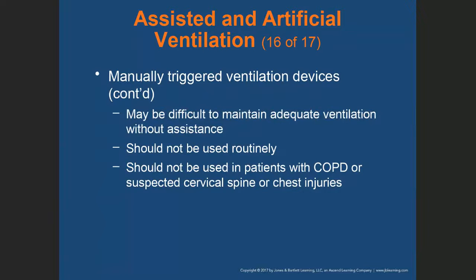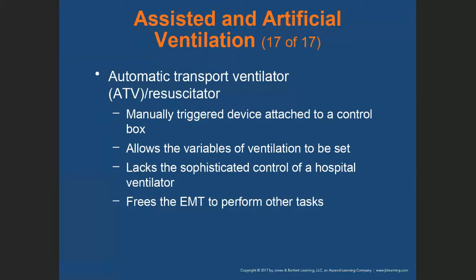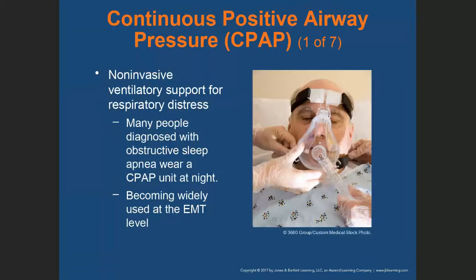Right, so I'm not going to spend a lot of time on that. The ATV is similar to the mechanical one. The difference is you don't have to press any device, right? You just put in the settings and it will ventilate the patient on its own based on the settings. Not something you will see in the field. You see that more in the hospital.